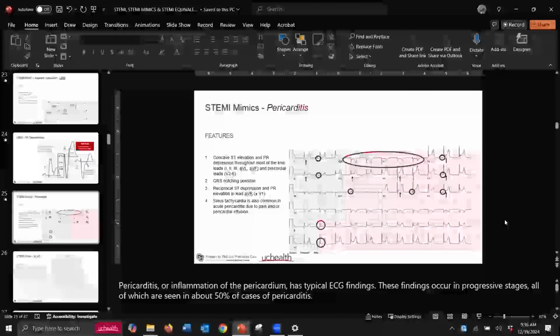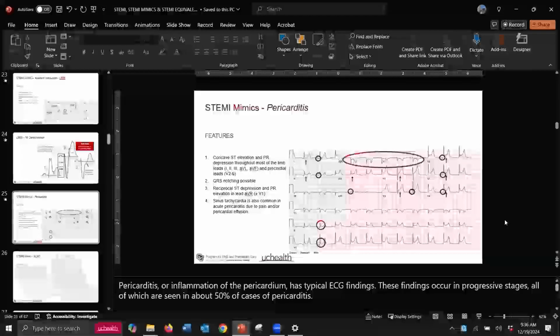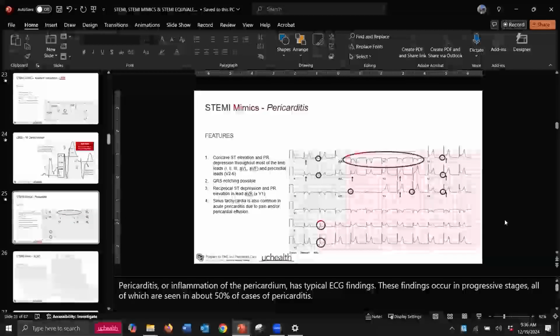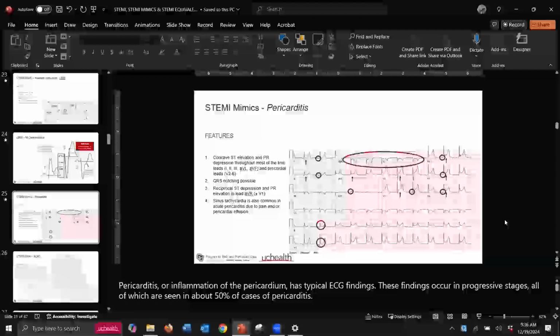Truly, what is the diagnostic factor for saying this is pericarditis? History of infection, probably. Might, that's an inclusion criterion, right? Gotcha. Labs. Labs and things that we can't do in the field, right?